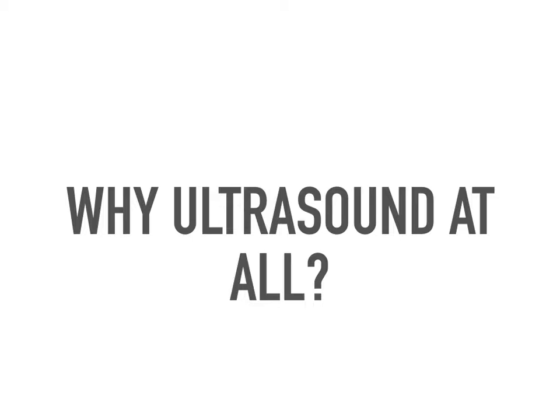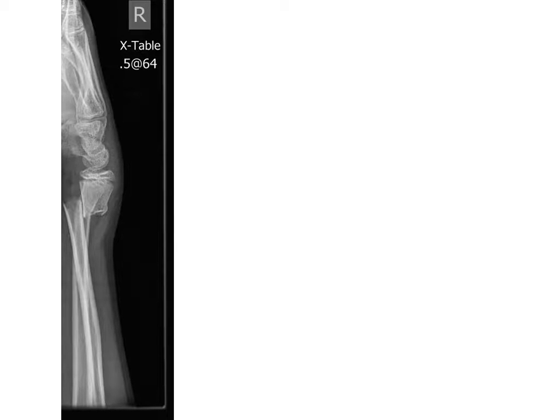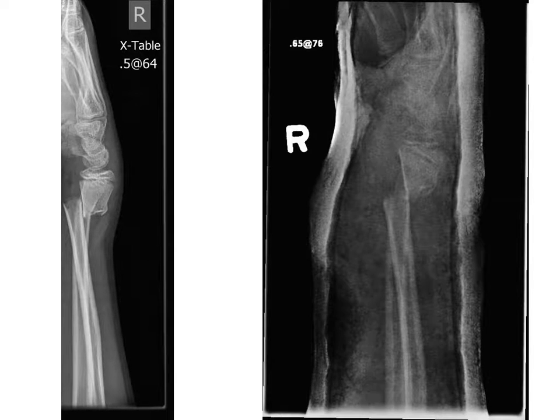A couple reasons come to mind. Firstly, ultrasound can be used more rapidly than X-rays to help during fracture reduction. We can use it at the bedside in the midst of the reduction to show that the initial fracture has or has not been reduced adequately. This could have potentially negated the need for resedation in this patient, along with all its inherent risks.